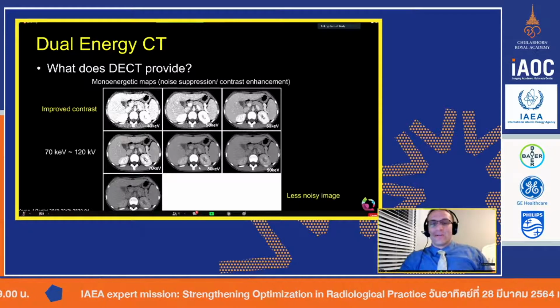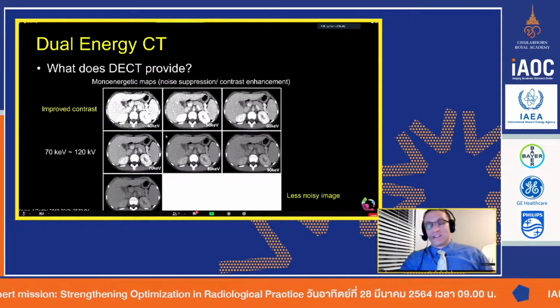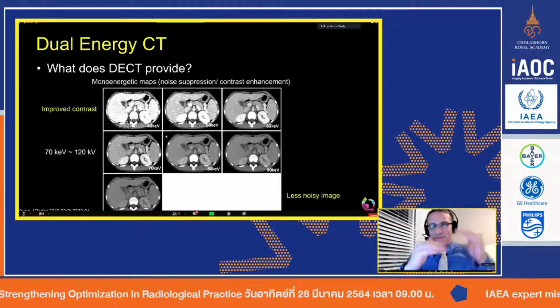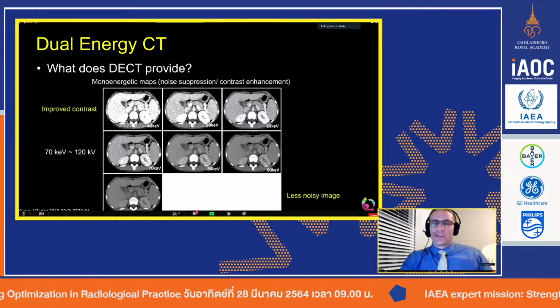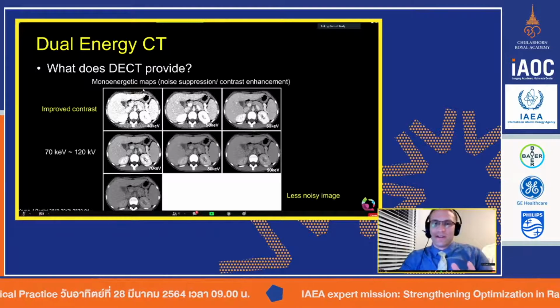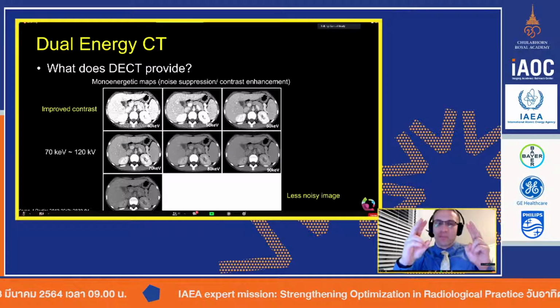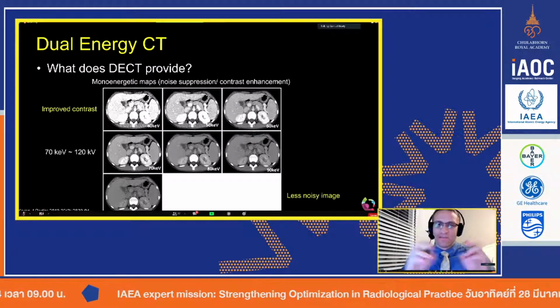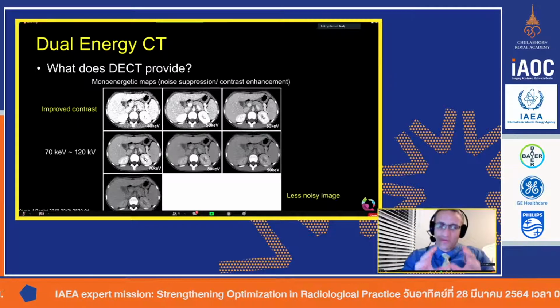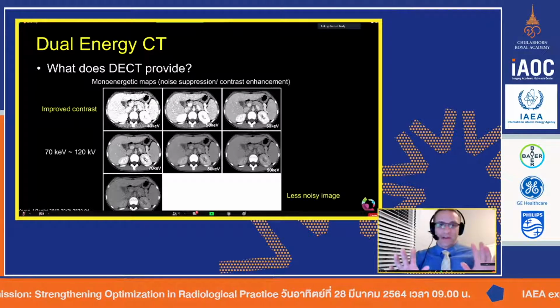The closest thing we can get to monochromatic imaging is breast imaging, just because we have really low energy with the different filters. So don't get too caught up on the fact that we call these monoenergetic maps. They are meant to be like a monochromatic image, but they're not truly monochromatic. So the distinction is purely mathematical. Let's just put it that way.